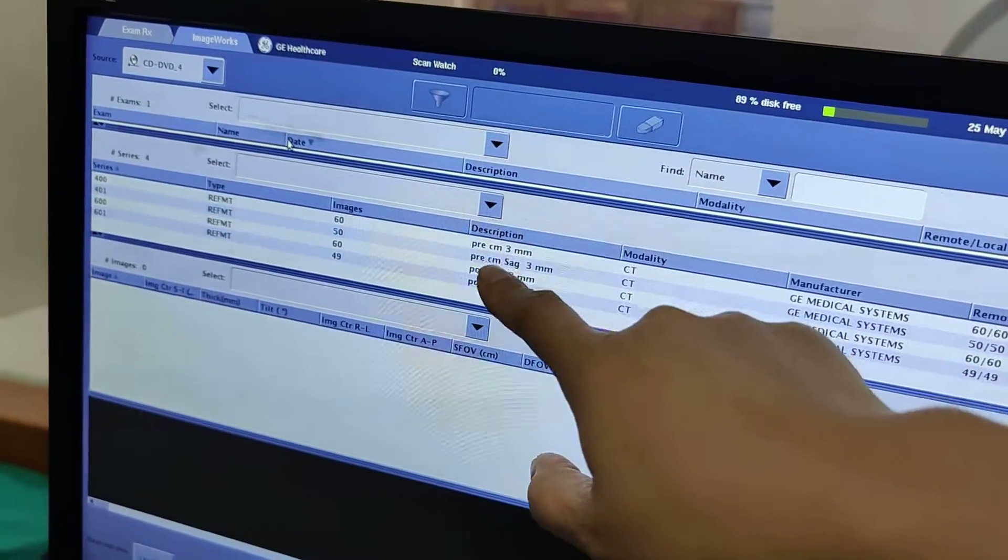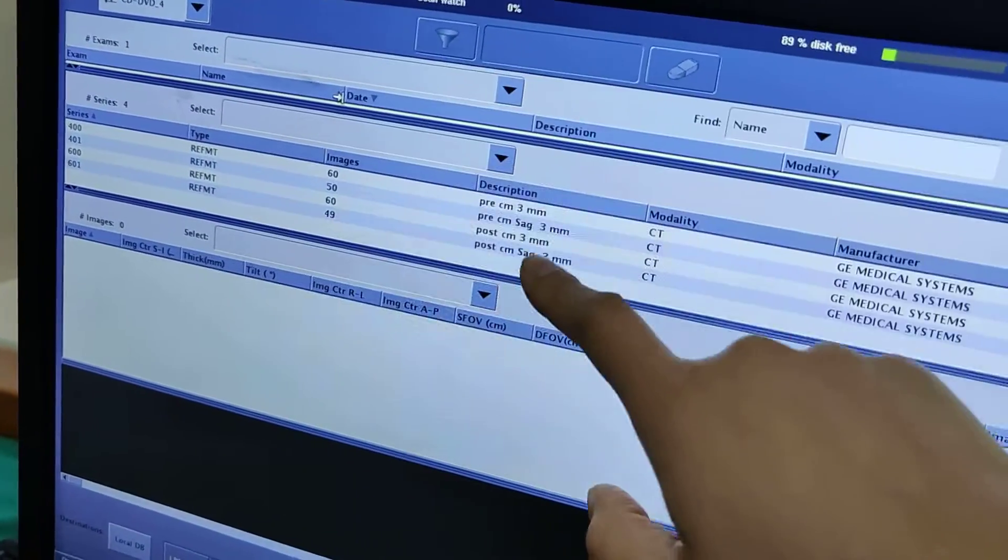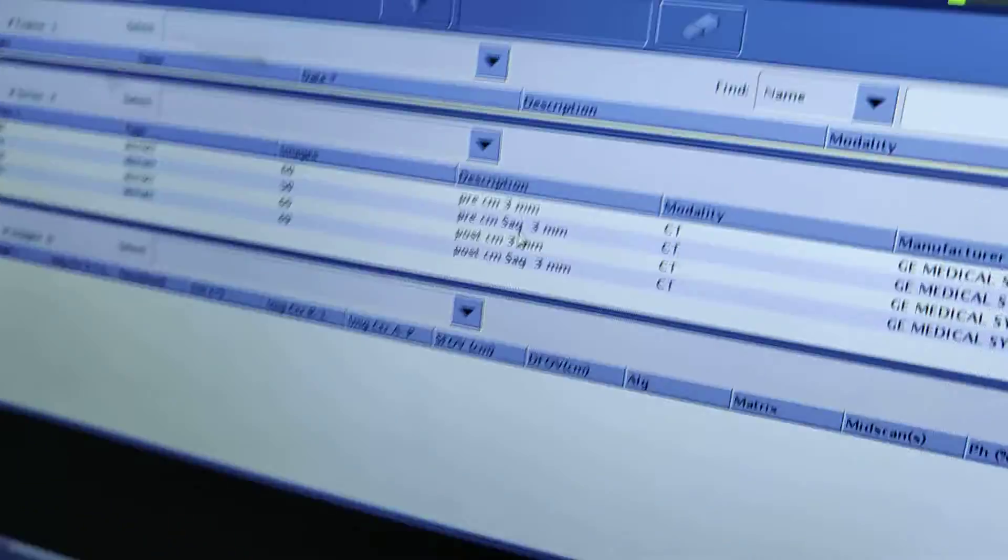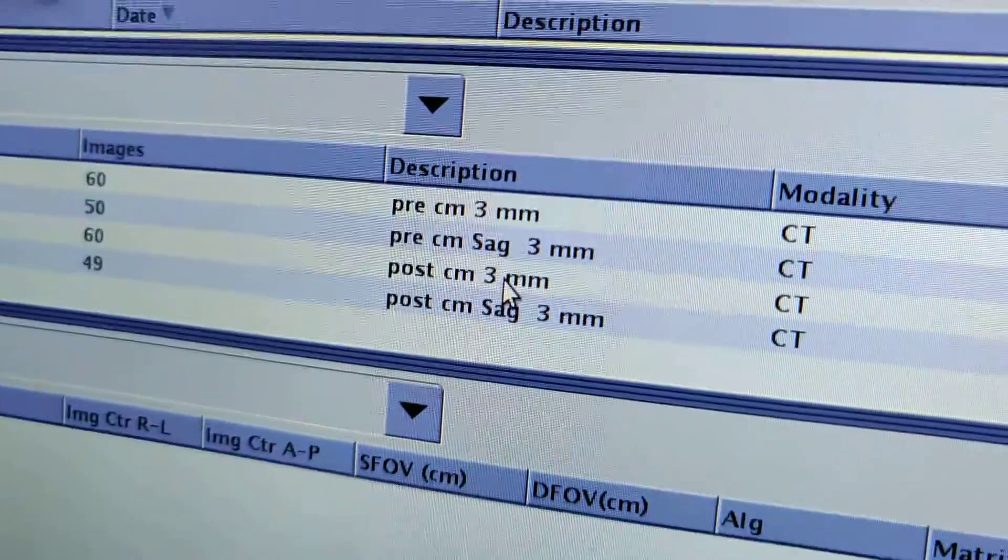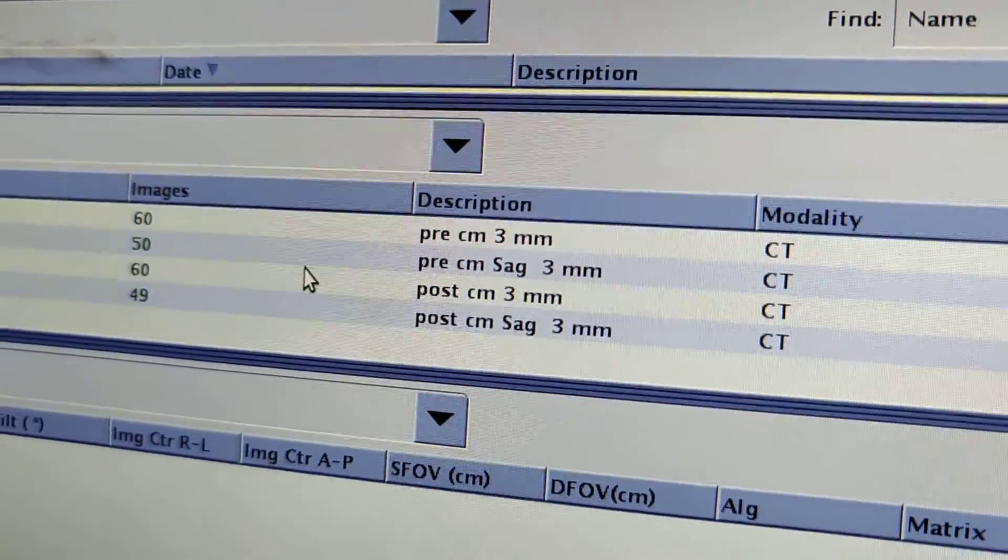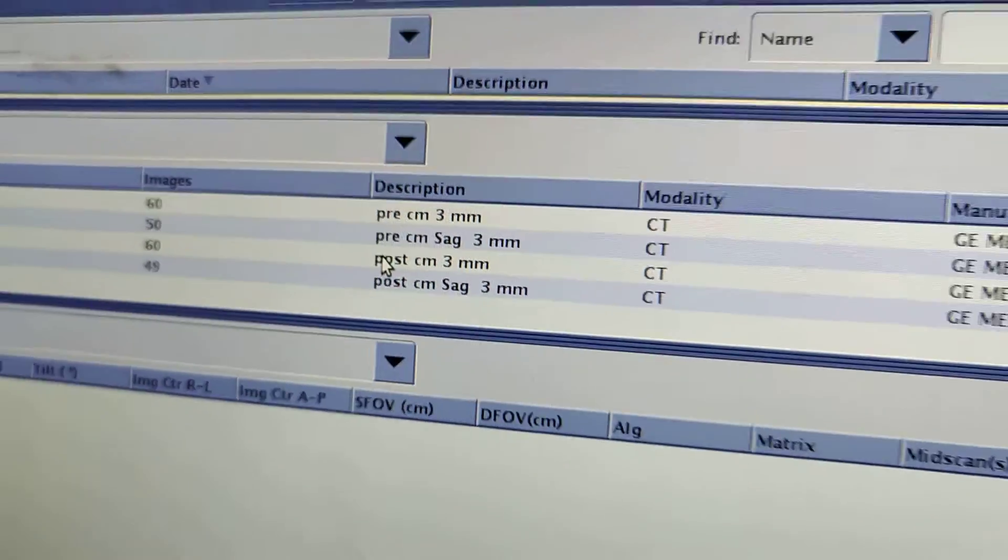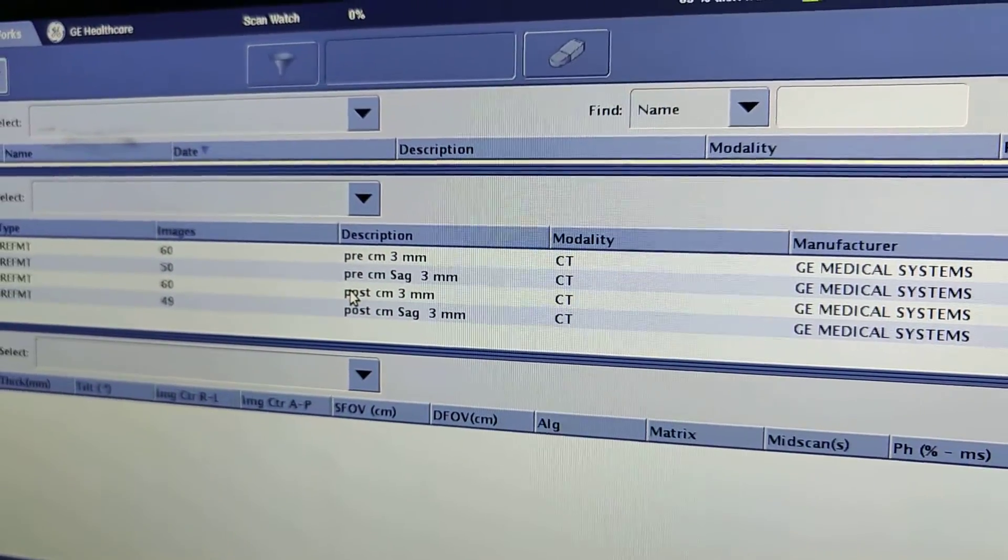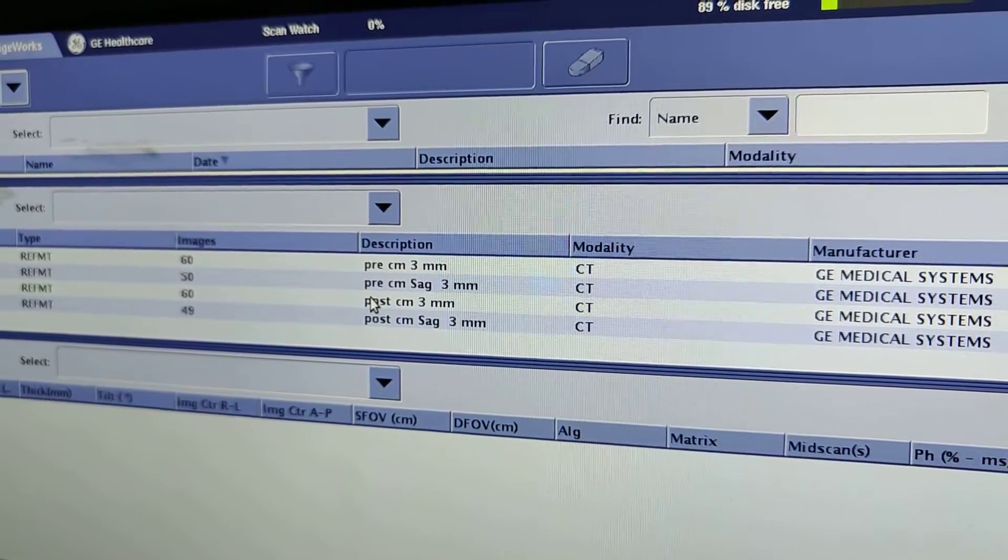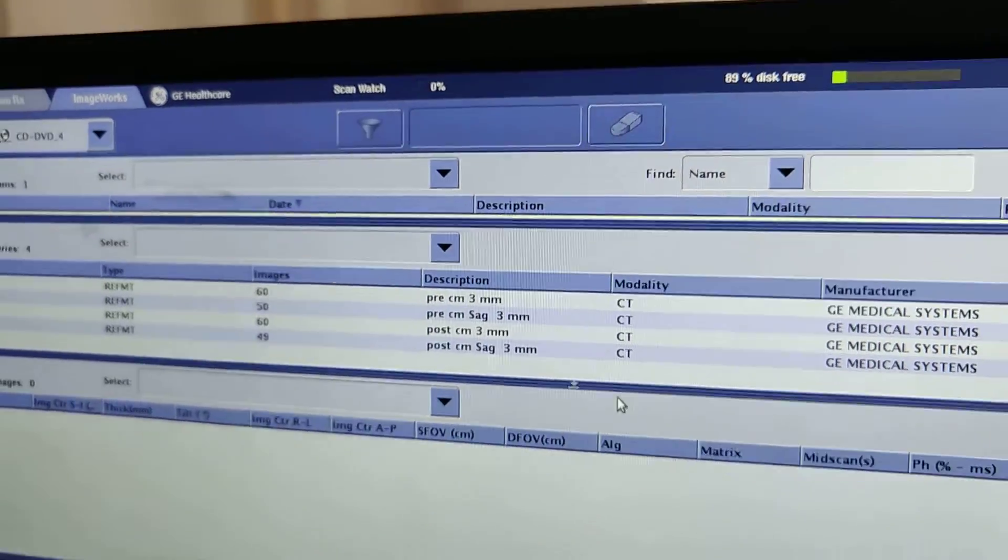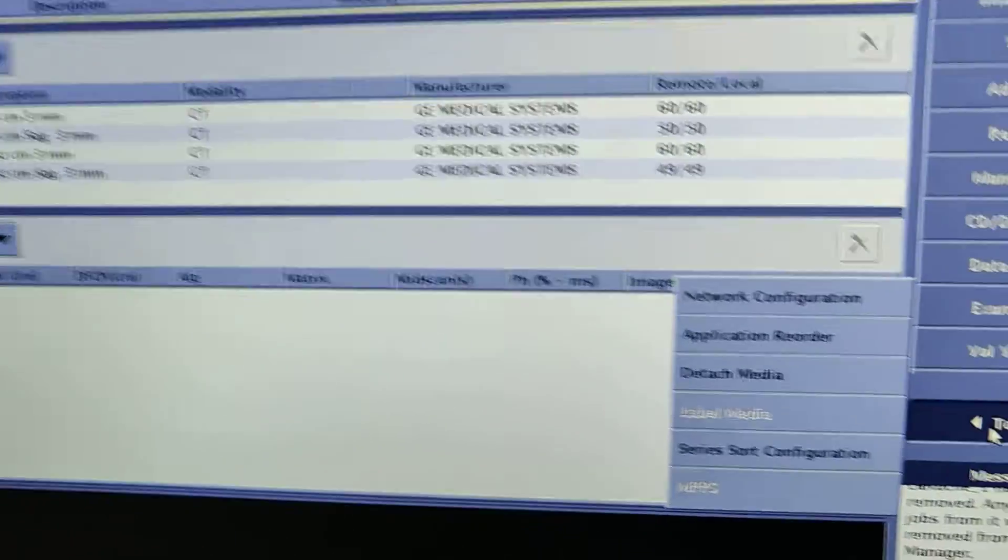So there's a pre-contrast three millimeters, pre-contrast sagittal, is there a coronal? Okay, so that's what you do, and that's how you find out what's on there.